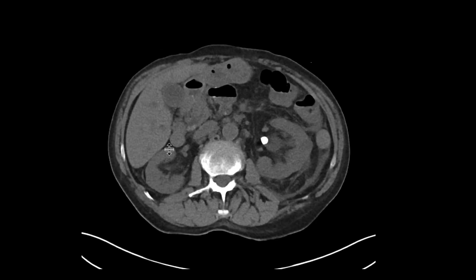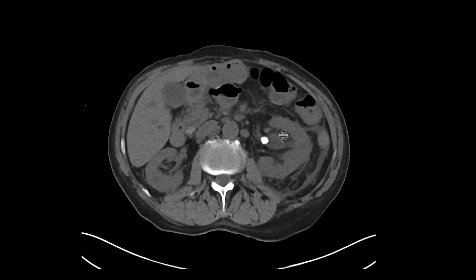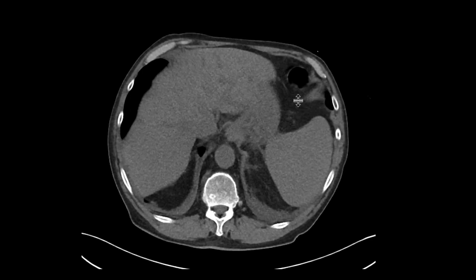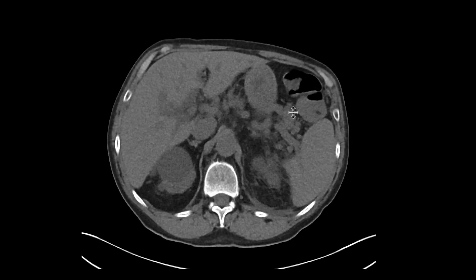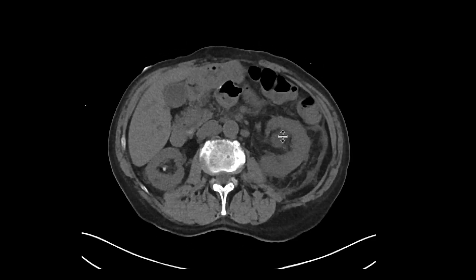And right at the bottom, we have a couple of filling defects. They're hyperdense, look somewhat triangular and geographic in shape. These findings are compatible with choledocholithiasis, causing biliary ductal obstruction in this patient who presents with abdominal pain.